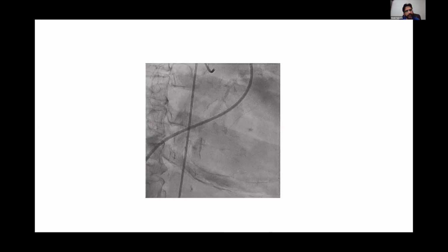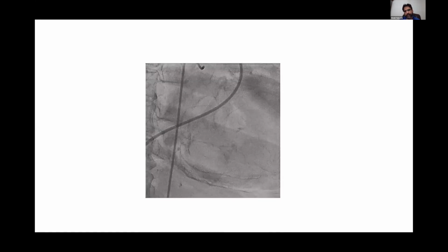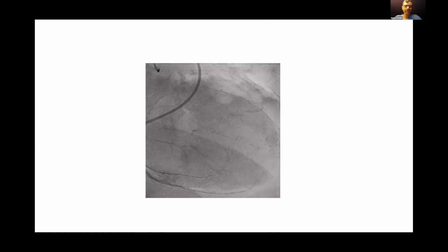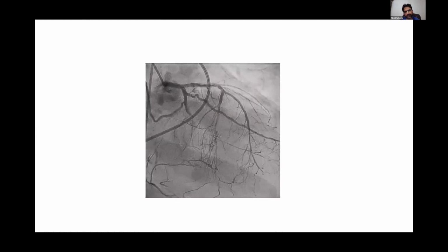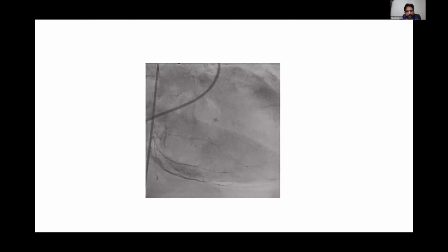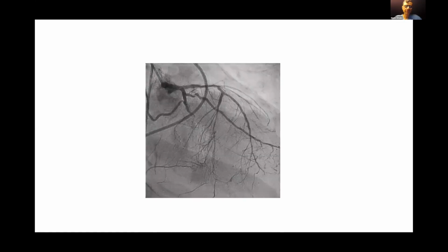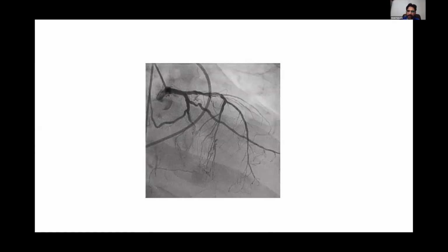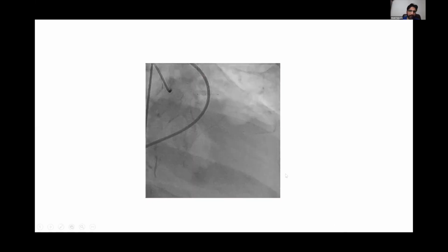It's a stent that was placed about 19 or 20 years ago in India in the setting of an acute MI. It's got these two markers at the proximal and distal edge. So I looked it up online, and I think back in the late 90s, they would put these gold markers. So this is probably one of those.